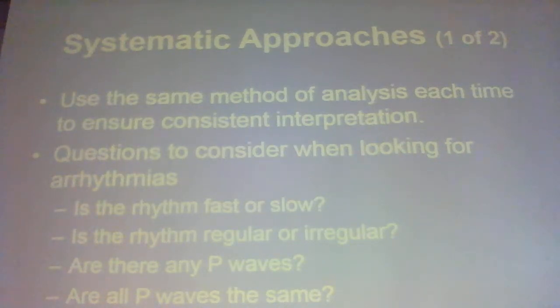All right, so looking at 12 leads the same way every time will ensure that you don't miss something. Okay? So the first thing you do is at the very top, you look at the rate. Should be within normal limits, right?